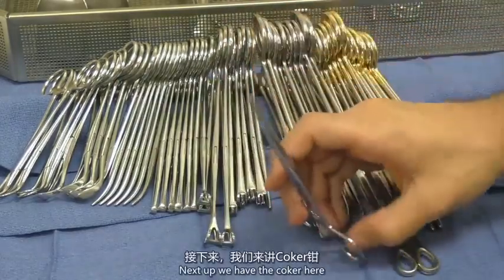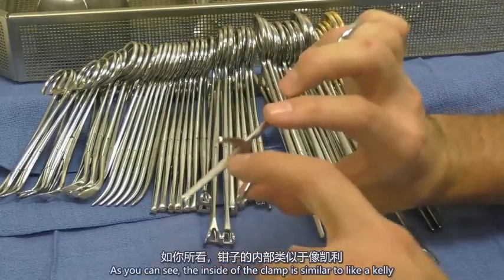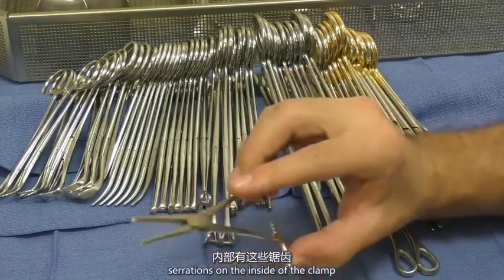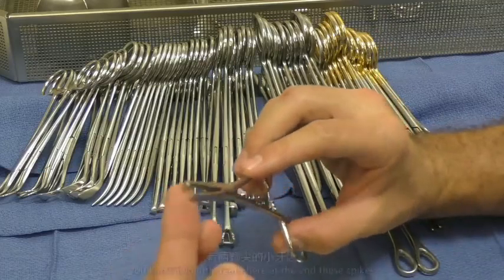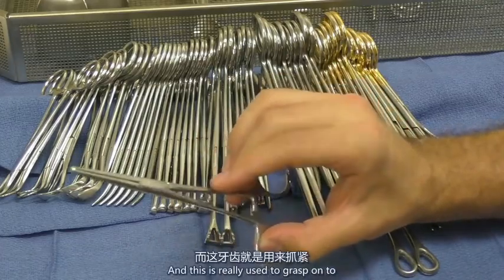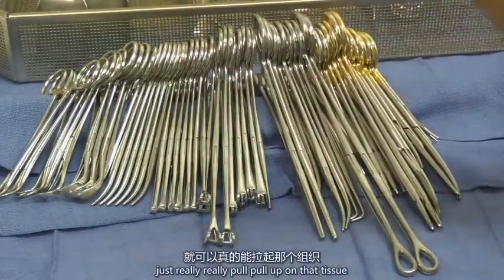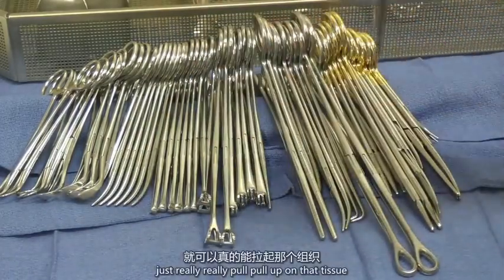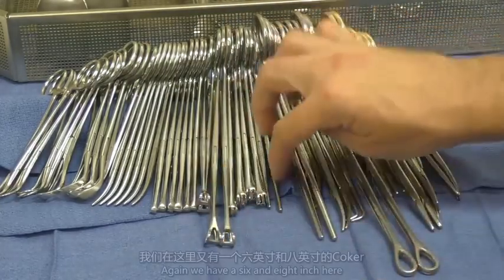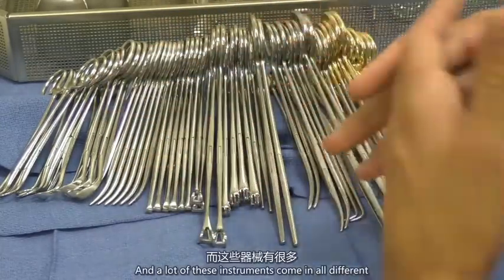Next up, we have the Coker here, or the Rochester-Ochsner Coker. As you can see, the inside of the clamp is similar to a Kelly, where it just has these serrations on the inside of the clamp, but it has these teeth, two little teeth here at the end, these spikes. This is really used to grasp onto tough tissue and really pull up on that tissue to get it out of the way, get a better view for the surgeon, that type of stuff. Again, we have a 6 and an 8-inch here, and a lot of these instruments come in all different lengths as well.